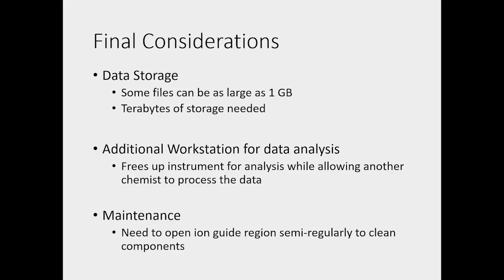The maintenance isn't too bad. We don't do too much maintenance, but you might need to open up the source to clean it, and it's not too much more complicated than cleaning a GCMS source. You want to make sure you don't hit the wrong button though, because it will sound like a dying animal. Not that I've done that. But you can also wipe down the orifice with methanol, and you can switch out a ceramic cap if the cap becomes dirty.